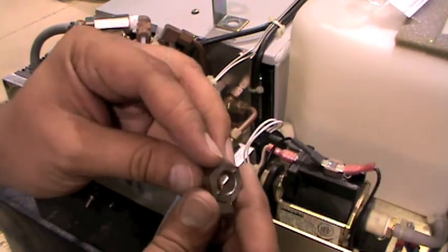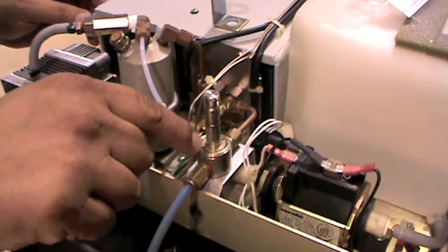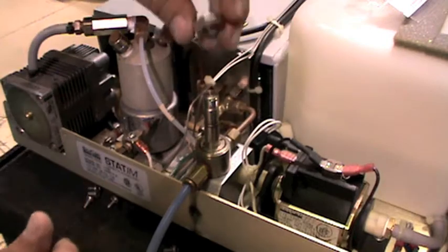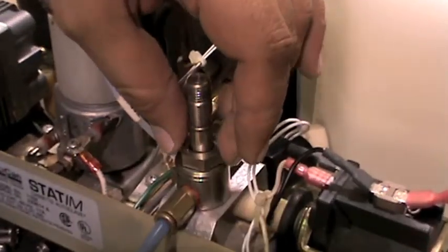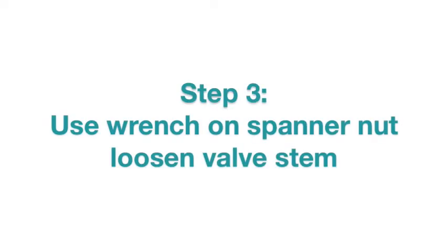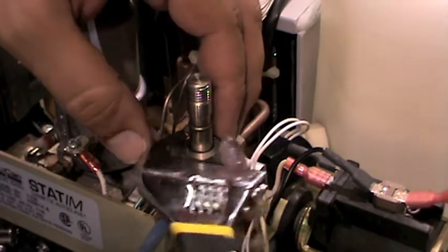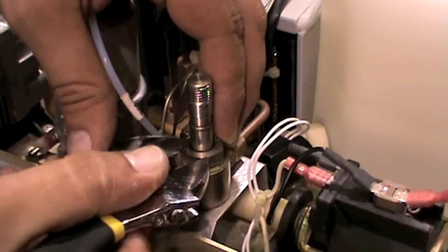Next, place the spanner nut over the valve stem or plunger tube and align the spanner nut pins with the base of the valve stem, as seen here. Then, using a wrench on the spanner nut, loosen the valve stem to access the internal parts of the solenoid valve.